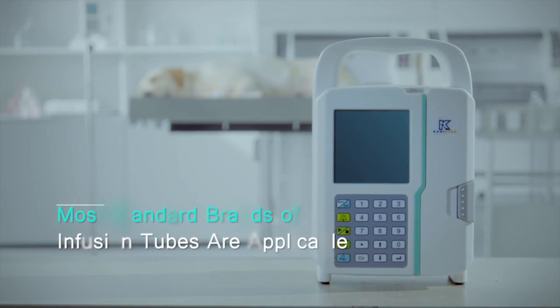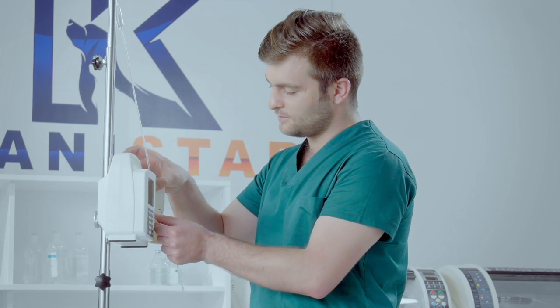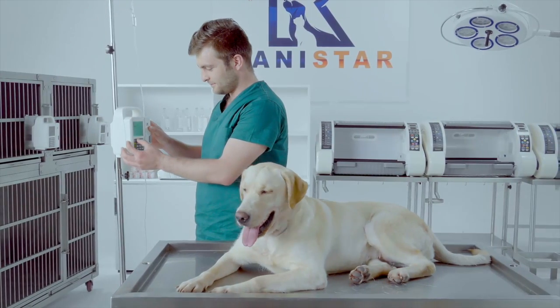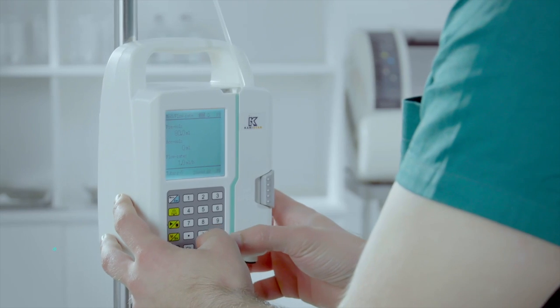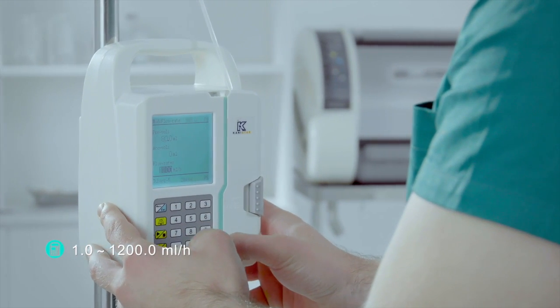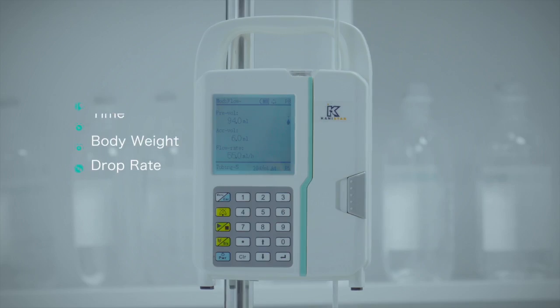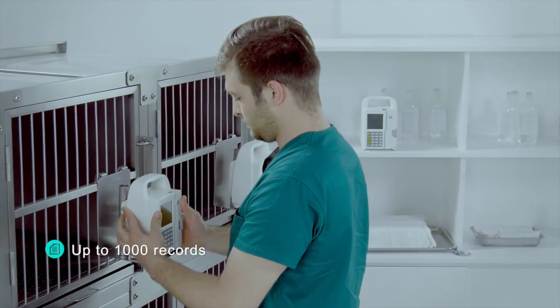Most standard brands of infusion tubes are applicable. The LP1900 has a large preset library with the majority of tubing lines on the market stored in memory. This helps users set up lines with a few simple steps and clicks. Wide speed ranges from 1.0 to 1,200.0 millilitres per hour. Four basic modes of operation are available, and historical records keep up to 1,000 cases in memory.